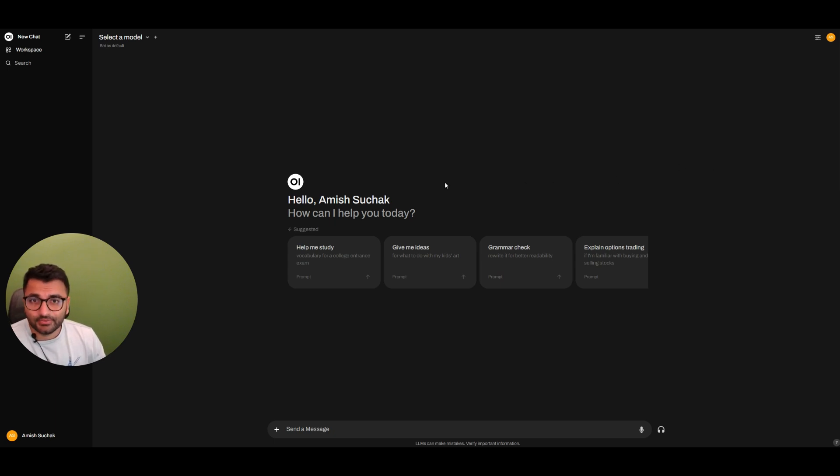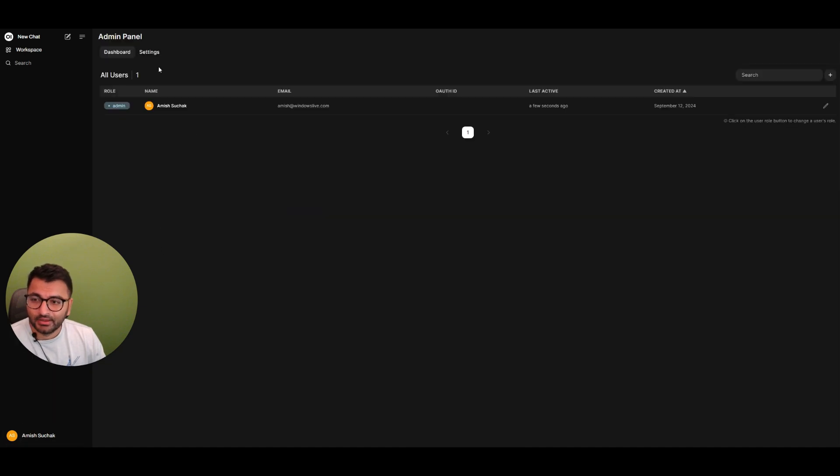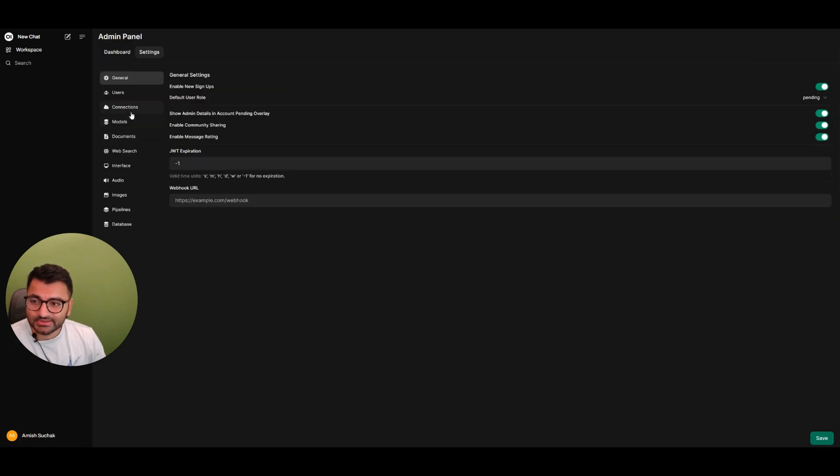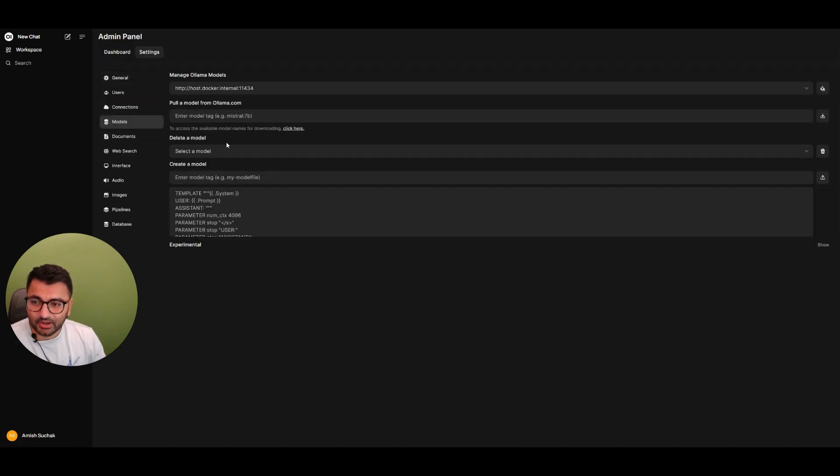To start off with, I'm going to first go over to my admin panel. Here I'm going to go to settings, select models, and I'm going to pull a model from olama.com.